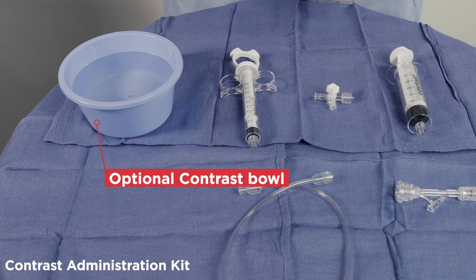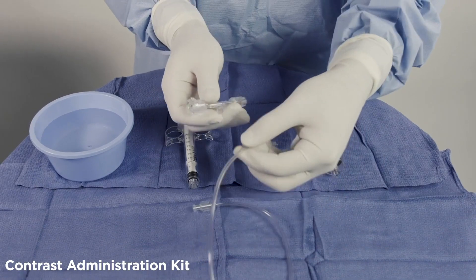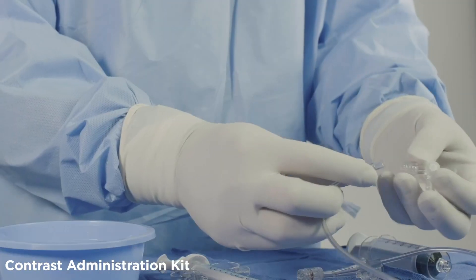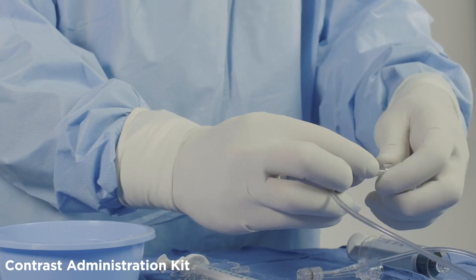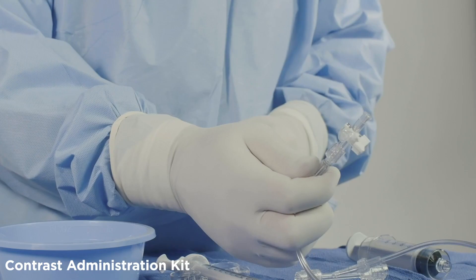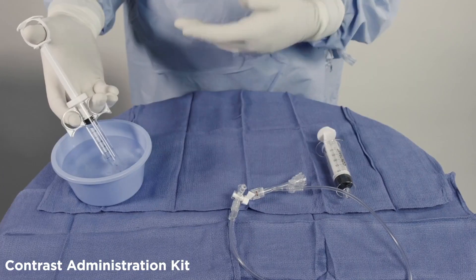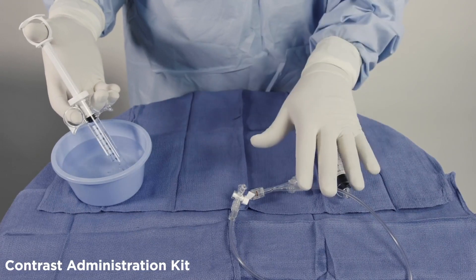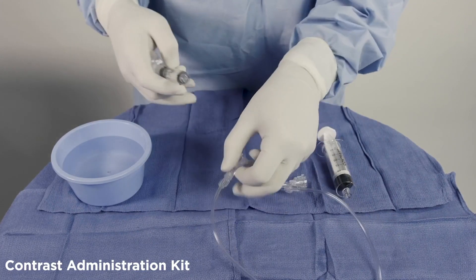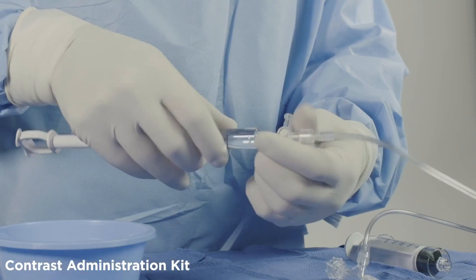For assembly of the components, first take the hemostatic valve and attach it to the tubing as demonstrated. This will help reduce confusion when attaching the next component, the three-way stopcock. These two ends are for attachment of the contrast syringes. Next, purge all air from the system by filling the contrast control syringe with saline and attach it to the three-way stopcock so that it is in parallel line with the tubing.